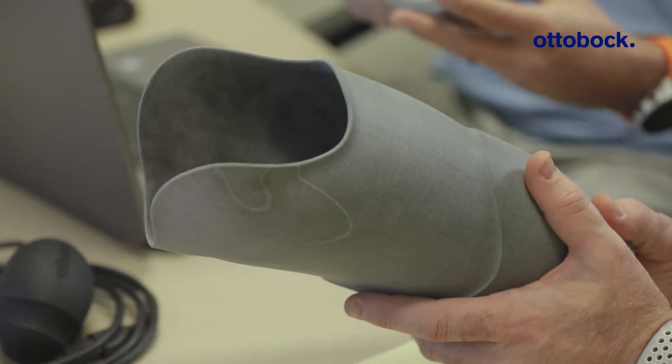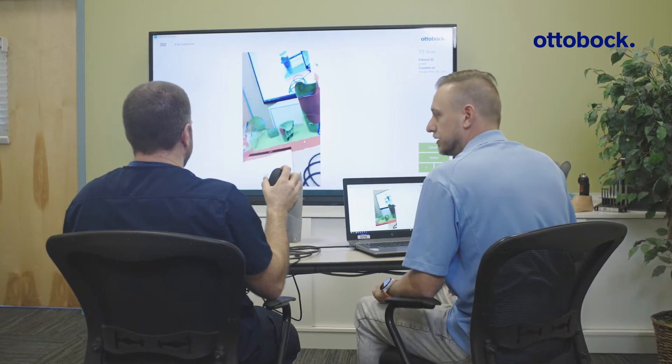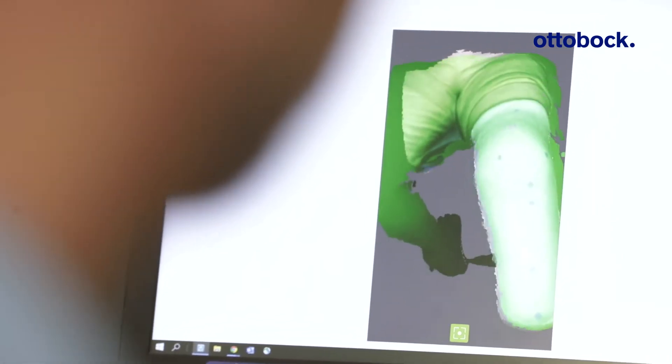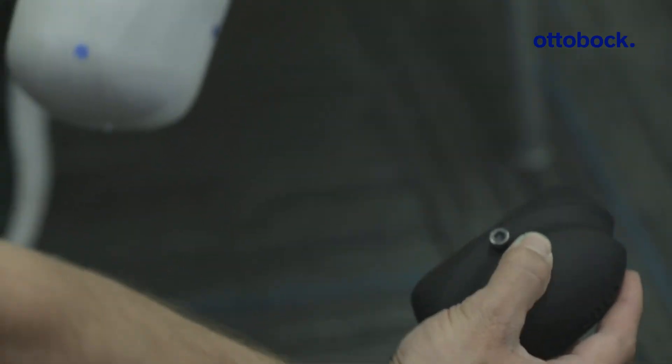The scanner you just hold in one hand with the digital display on your computer. It's now very simple — I can do a scan in as little as 20 seconds and then finish modifying in as little as 15 minutes. The tracking is also really fast. If you suddenly lose track of your object, you can move it back to a previous area where you scanned and it will track again usually within a second.